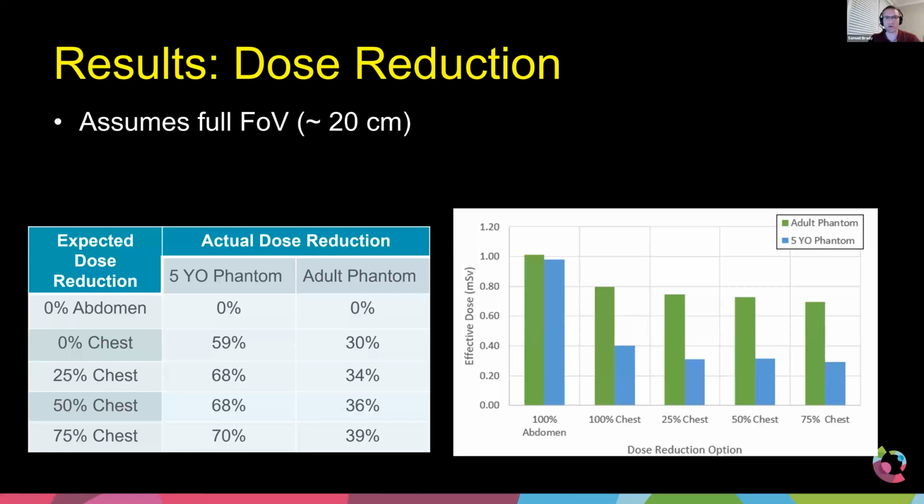20 years ago, we were imaging kids and adults roughly the same in traditional CT. There were really no considerations for pediatric imaging. And then obviously we realized that we were overdosing kids by 4 or 5 times as much. So fast forward now, our kid doses are so much lower, and so are our adult doses. We're at that same point now for CBCT in the C-arm or the interventional fluoroscopy system.